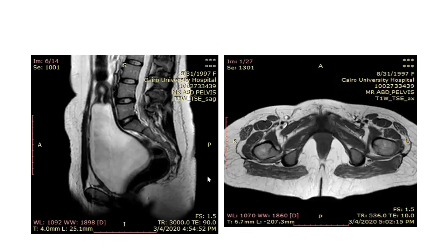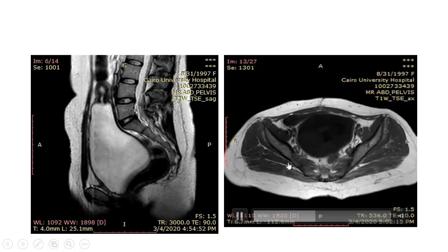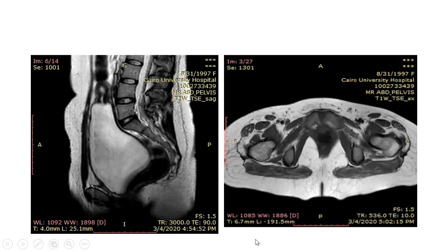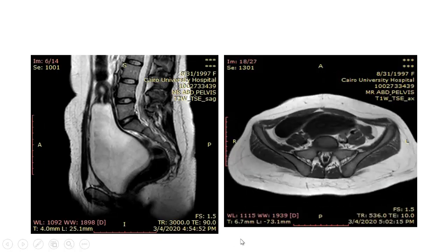I asked for the previous examination on the PACS. This is an MRI showing bright signal on T2 with the uterus above here, and this vagina. We must do T1 to see the consistency of this fluid. It is fluid and it is not blood. It is fluid like that in the urinary bladder. So we have hydrocolpos and not hematocolpos in this case. Why, I don't know, because she has a well-developed, good uterus. About the ovaries, I think we couldn't see them well on MRI because of the compression, but they are mostly present.